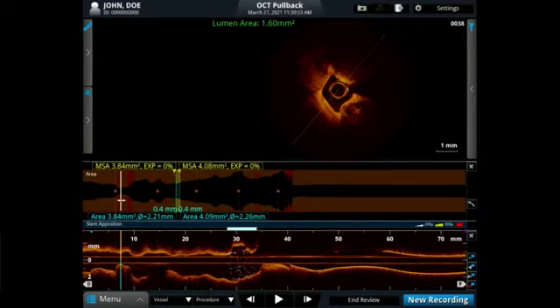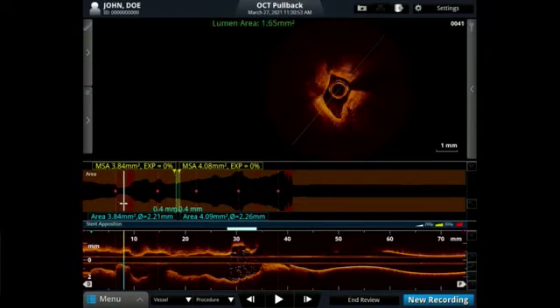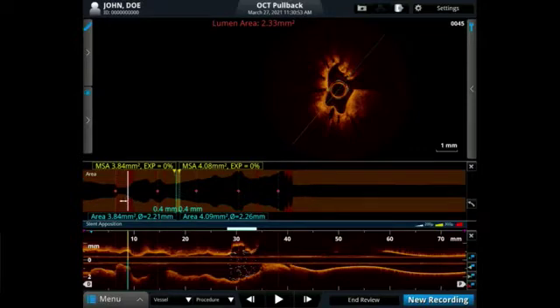Both are thick calcium. There's probably more calcium here. There's one here, there's one there. A lot of deep ones, a lot of deep and thick ones. That's the highlight, I think, of this OCT. This is right at the distal edge of the stent. So the pathology starts at the de novo and creeps back up to the stent.